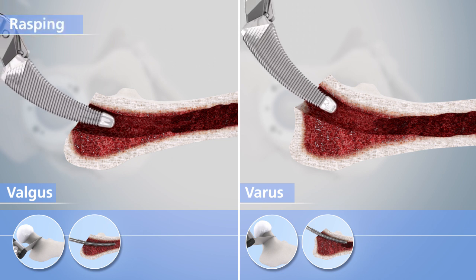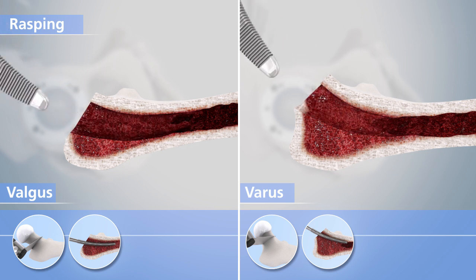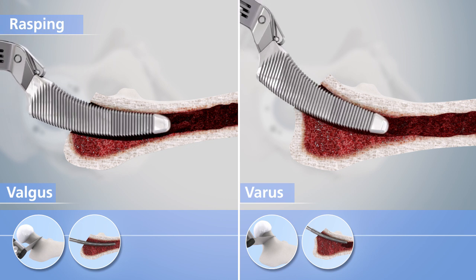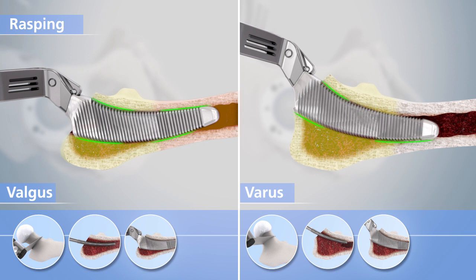Preparation of the implant bed begins with the so-called starting rasp in accordance with the entry planes described above. While rasping with slight lateral pressure is allowed already here in valgus anatomies, in varus hips this is to be avoided. Here, the preparation uses the so-called around-the-corner technique. Preparation using ascending rasp sizes is carried out until reliable press fit and rotational stability of the rasp can be achieved and no further advancement into the femur by hammer strokes is possible. While, in addition to metaphysial anchoring, fit and fill in the proximal diaphysis is desired in valgus hips, in varus anatomies the goal is to achieve metaphysial anchoring with three-point support.